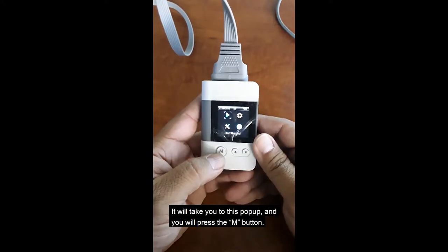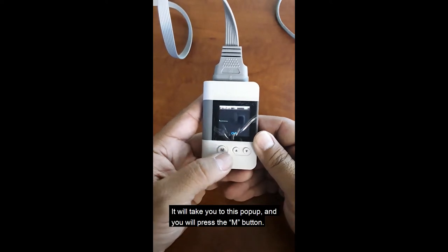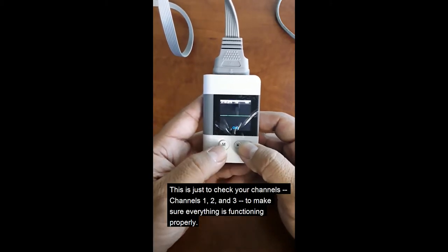It will take you to this pop-up. Push the M. This is just to check your channels — channels 1, 2, and 3. Make sure everything is functioning properly.